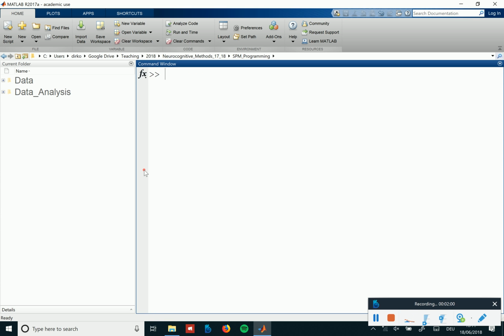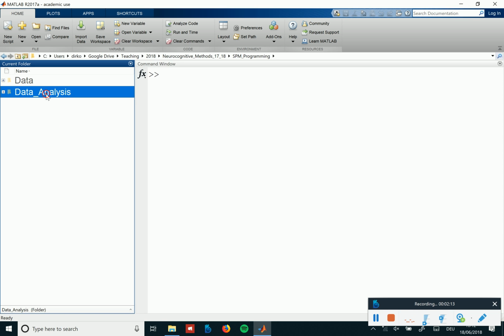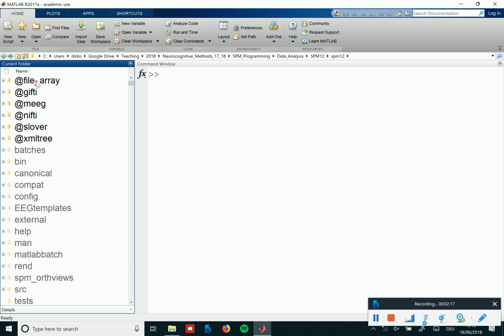The first thing I want to show you is how to create scripts in SPM, because that has really simplified a lot.